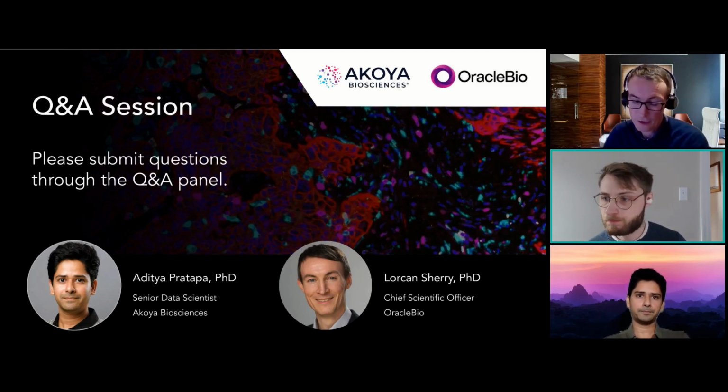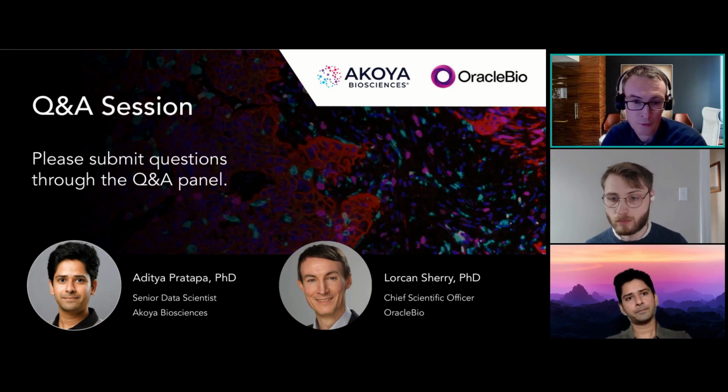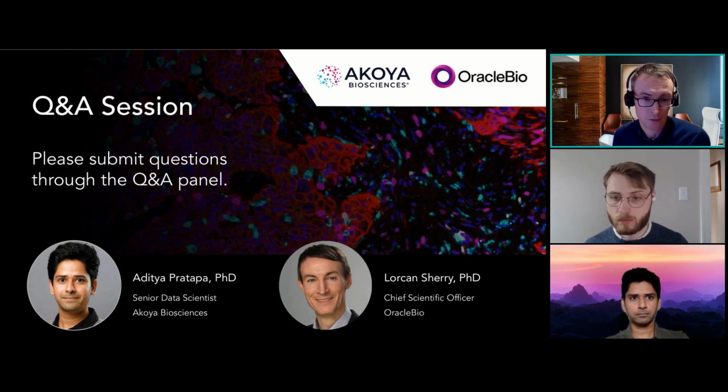Yeah, I talked a little bit about this in the presentation. It was certainly something that we started about 4 or 5 years ago and has been a constant development. We pretty much started due to the need to think about image storage. Multiplex IF images are quite large image files, so trying to store those locally on a hard drive, on an infrastructure internally on site was becoming more challenging. So that was one of the reasons we moved to the cloud, to get that scalable storage.